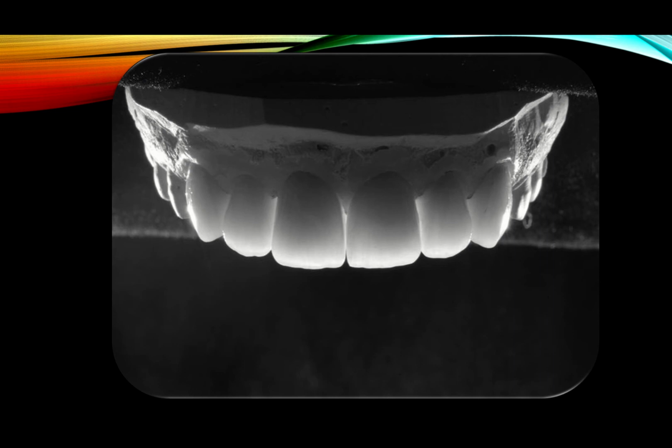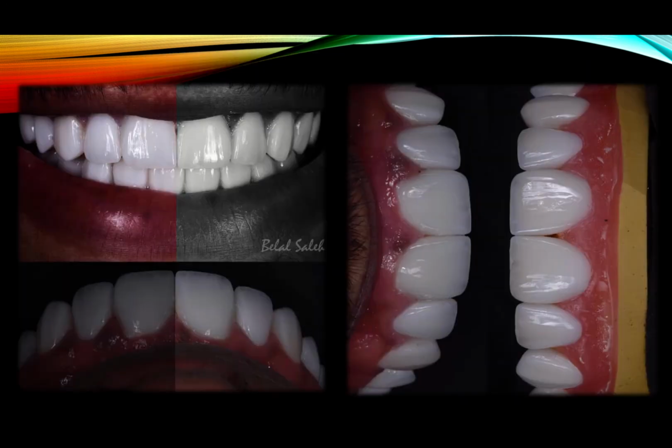Different photos. Lithium disilicates are much more translucent than zirconia, I still think, even though this is a low translucent B2 ingot. Now I showed this before, same thing.